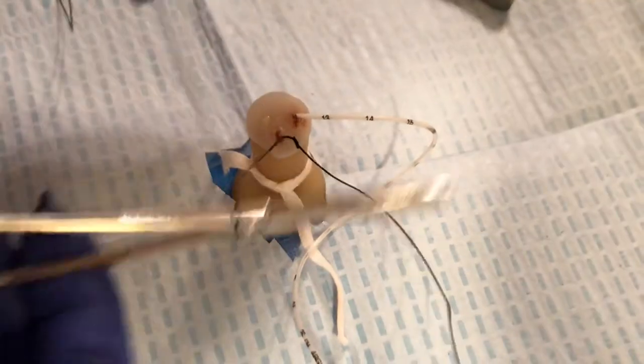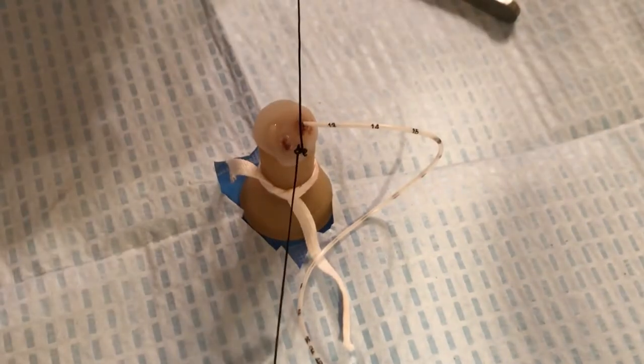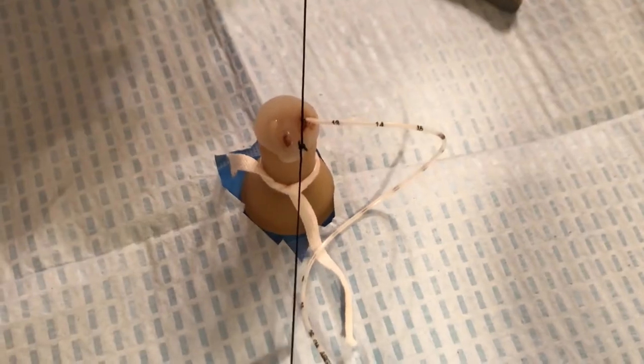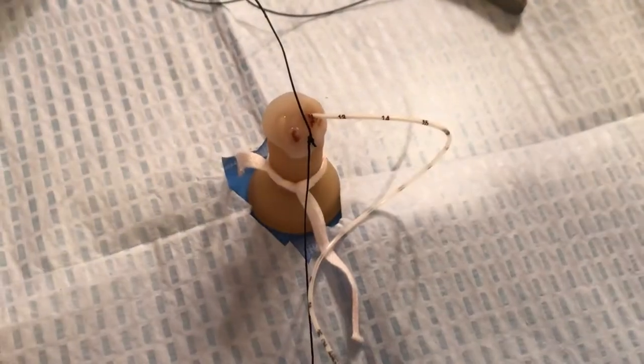There's our first instrument knot and our second instrument knot. That creates the first part of our base.